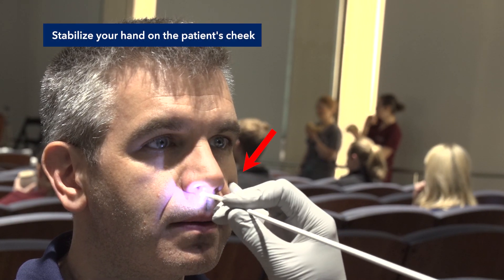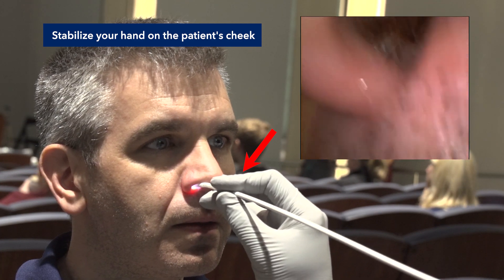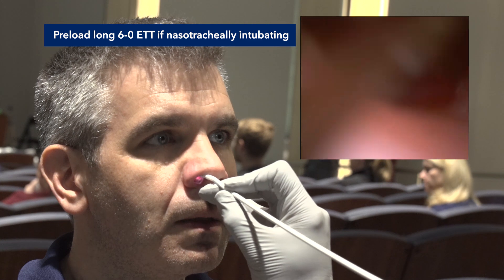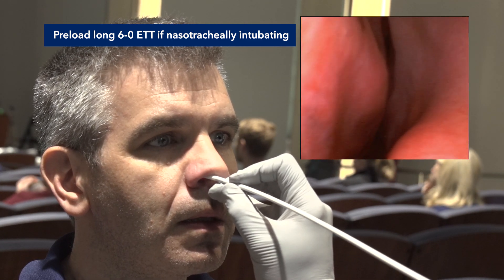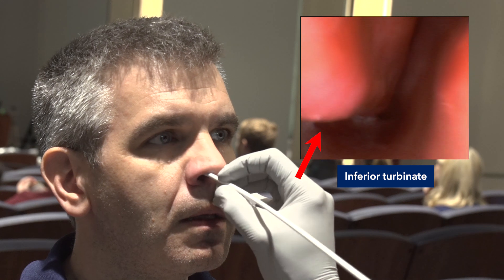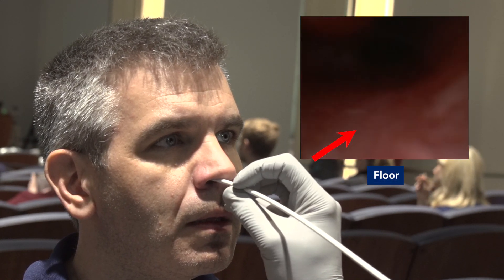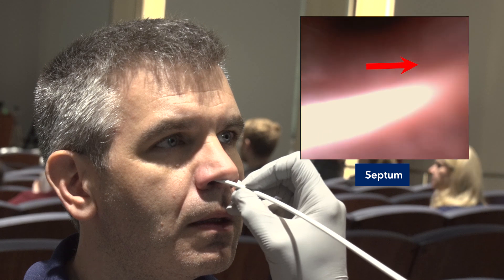Use your right hand to grab the distal tip of the scope, placing your fifth digit on the patient's cheek for stability and ensuring that your scope and scope tip are straight. Insert the distal tip into the patient's prepared nare. Identify the inferior turbinate and advance the scope underneath it, trying to stay off of the septum.